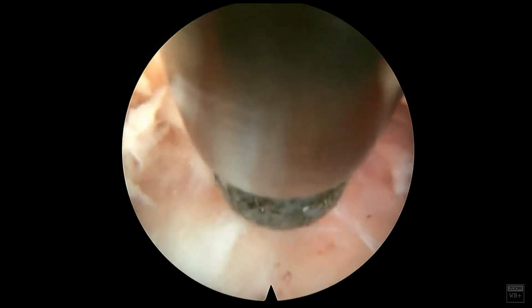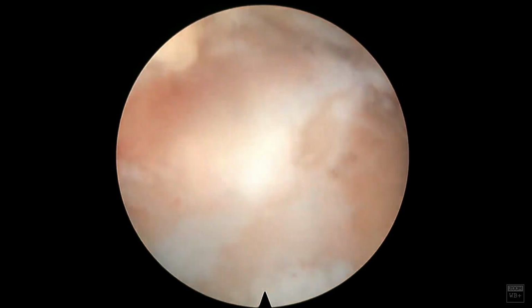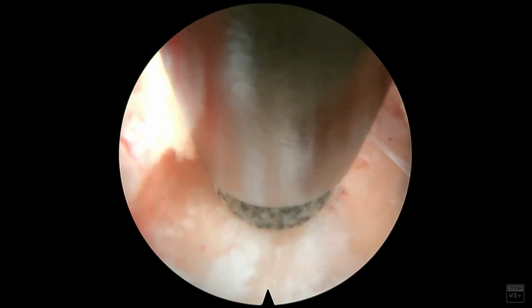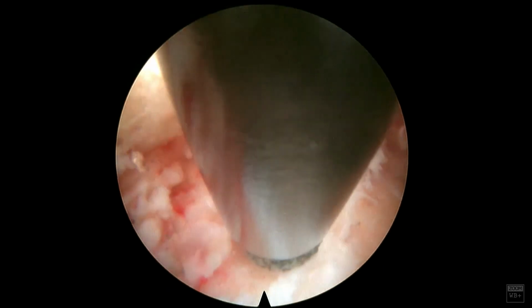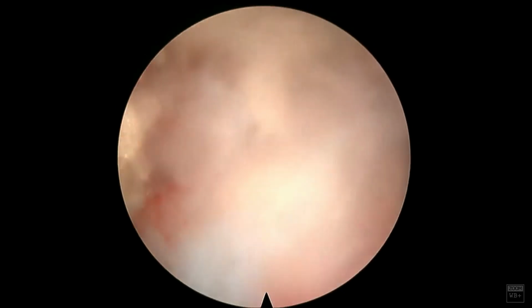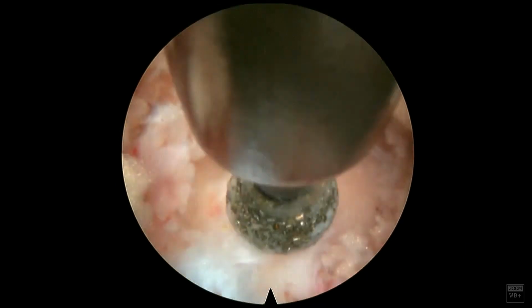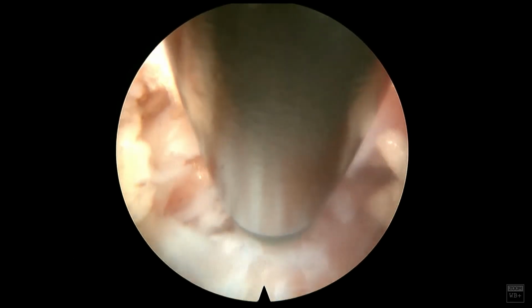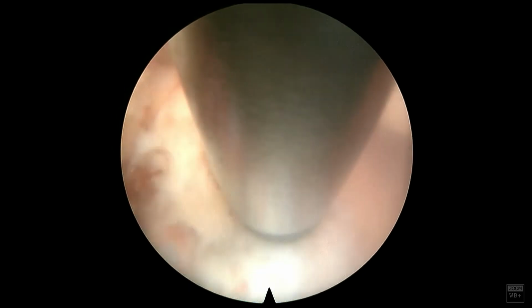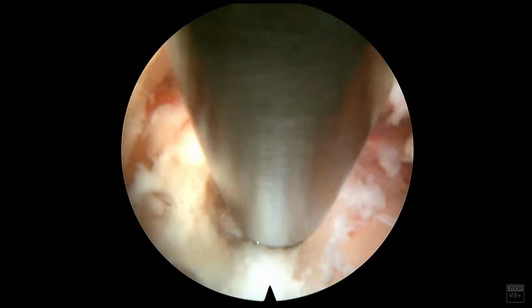And so how much do I remove here? Honestly, it's just kind of a guess. I'm using fluoroscopy in the lateral plane to check my depth. I start moving the disc space a little bit, checking for the annulus, because I know that the whole thing is not totally calcified. And so I can see some fibers of the annulus there. I know that the SAP was really the main culprit, as well as the hypertrophic ligamentum flavum attachment off of the SAP. So I'm not going to spend too much time doing this.